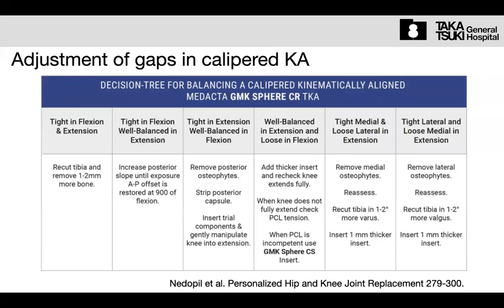Okay, so please remember. And what is another solution? The tight extension gap, but well balanced in flexion. So tight extension, but well balanced, good flexion.